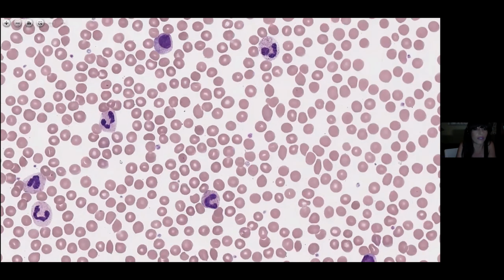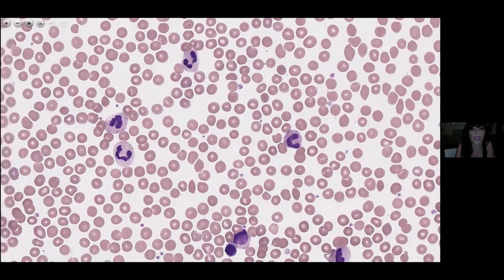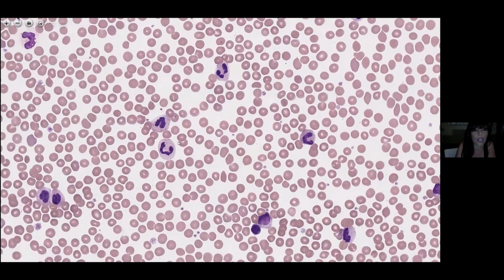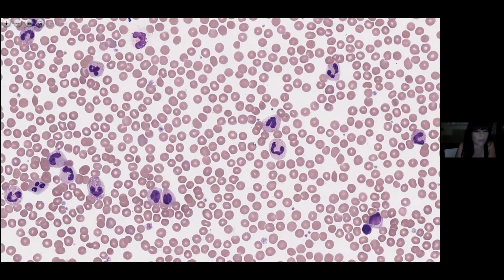So as a physician, do you feel like it's a useful parameter to have to know if someone has a left shift? Well, I think it's useful in some disorders. I think because of the comments here and what you've already mentioned, this case is a sort of mature neutrophil leukocytosis, neutrophilia. And if we're thinking, is this a leukemoid reaction?